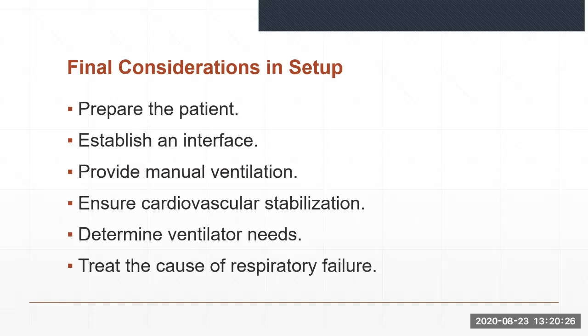Tracheostomy tubes must be inserted surgically, but these tubes can be used for extended periods. They also allow for easier pulmonary hygiene and are apparently most comfortable for the patient, even allowing the patient to talk in some cases.